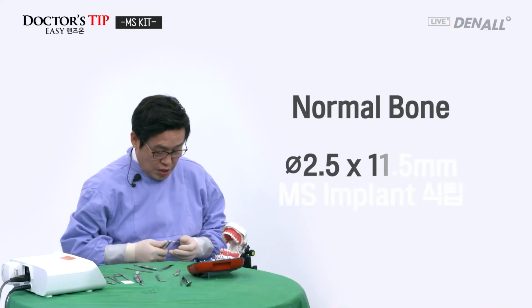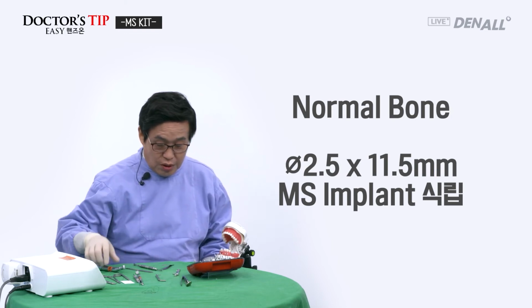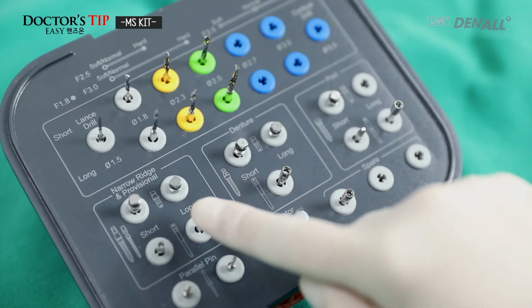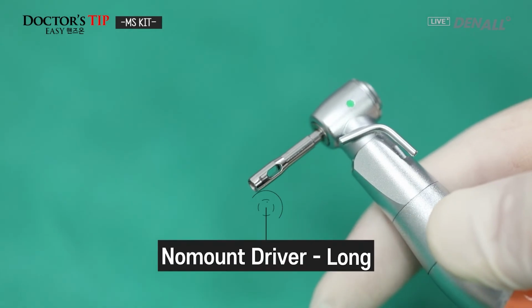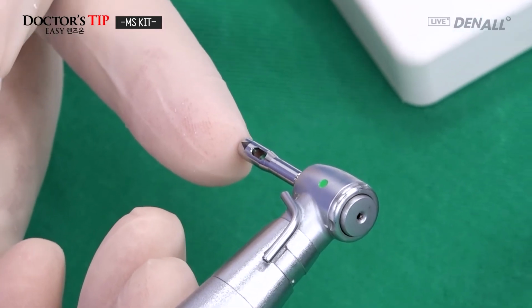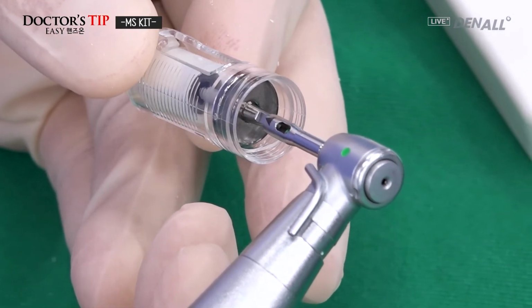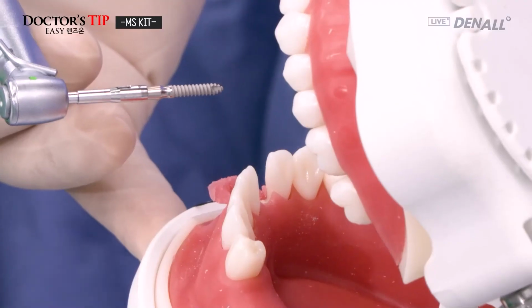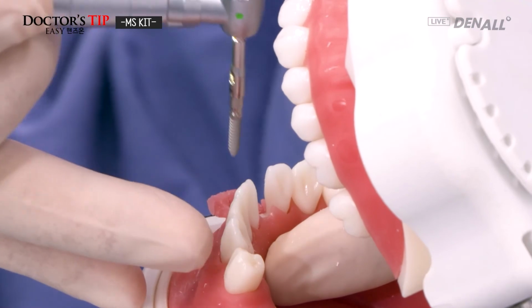Then, in the lower anterior side, let's assume it's normal bone. So the 2.5 by 11.5 MS implant will be placed. I will use the no-mount driver, the long type. Change to the placing mode, which is marked with the triangle, and that needs to connect to the MS fixture's flat part like this. Connect, and you pull it out, like this. Before pushing it into the mouth, you check that it's in the correct mode, and then place the implant.